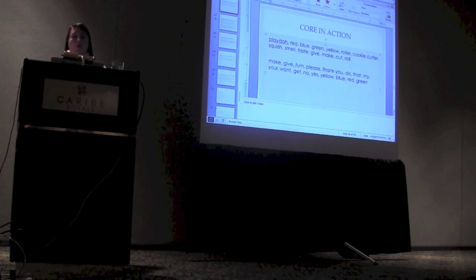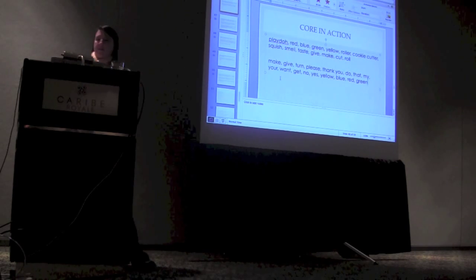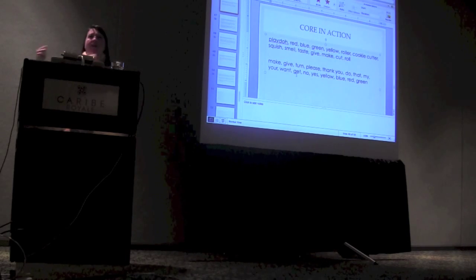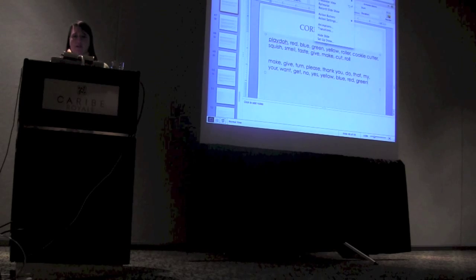If we had a board like this, our kiddo could take it to the next activity and still say, give me, want that, this one, right? Those core words didn't make it onto our Play-Doh activity-based list. Otherwise, we'd have to have a page for Potato Head, a page for dress up, and a page for the kitchen area. But if we're focused on core vocabulary, we can use this core really flexibly in a lot of different ways.